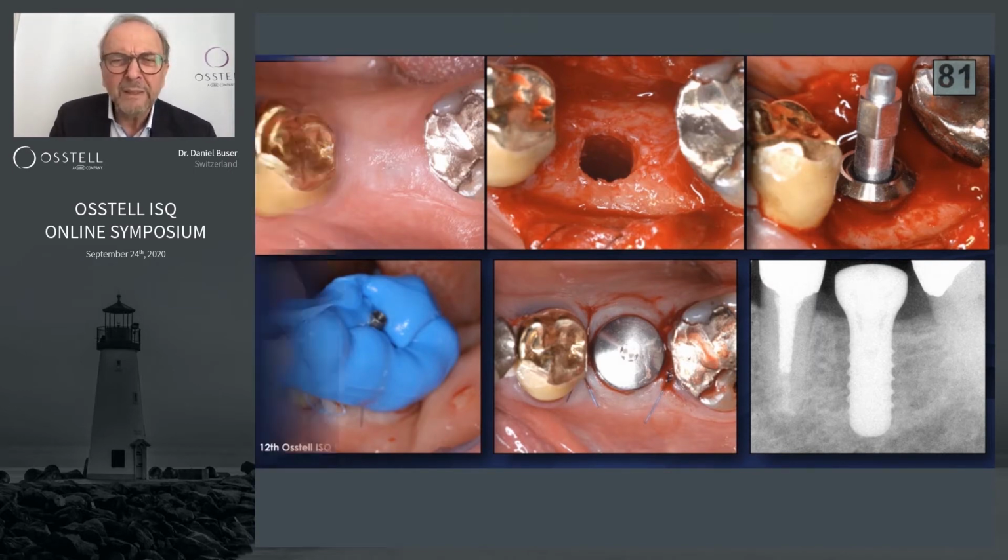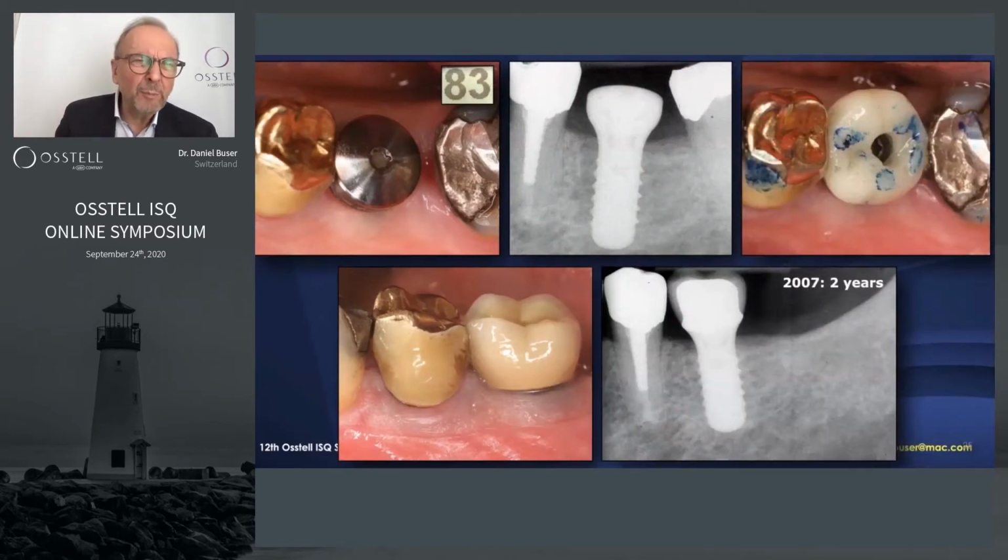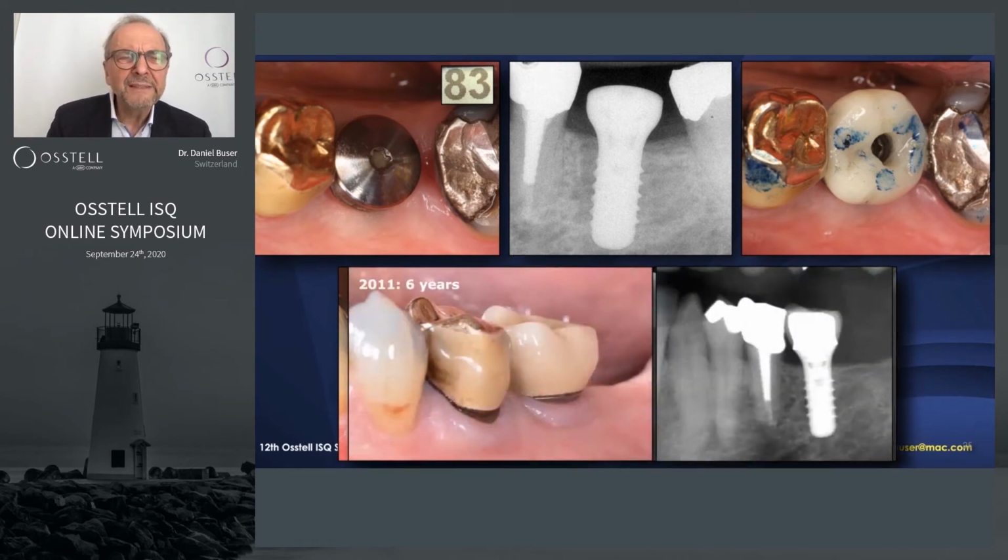You see the periapical. Then at 3 weeks, the patient comes back, everything perfectly healed. ISQ is 83, and then the provisional restoration was installed. And then 6 months later, another reading was done. You see, the second molar has been removed, and then the implant has been restored in private practice by the referring dentist, and you see the 2-year follow-up. Here you see the 6-year follow-up of this implant doing extremely well, so it's no problem at all.